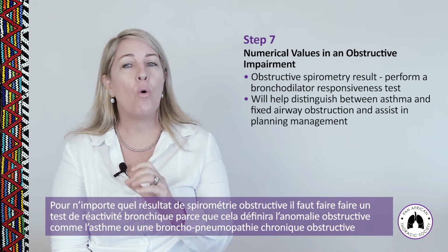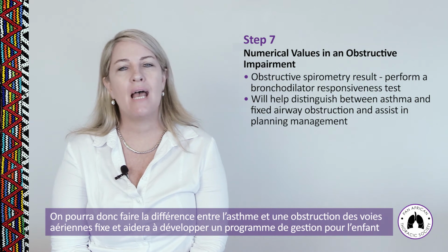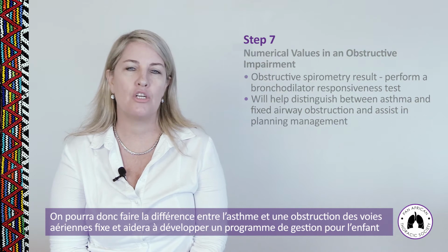For any obstructive spirometry result, perform a bronchodilator responsiveness test because this will define the obstructive abnormality as asthma or chronic obstructive pulmonary disease. This will help distinguish between asthma and a fixed airway obstruction and assist in planning management for that child.